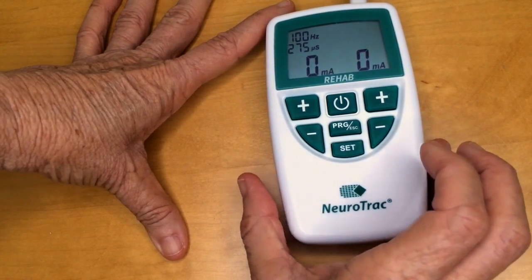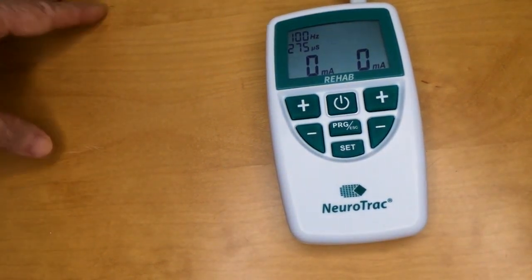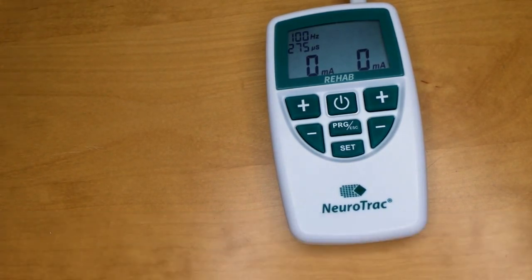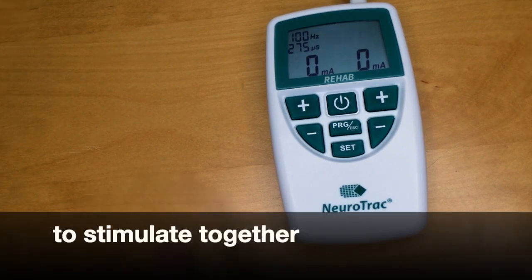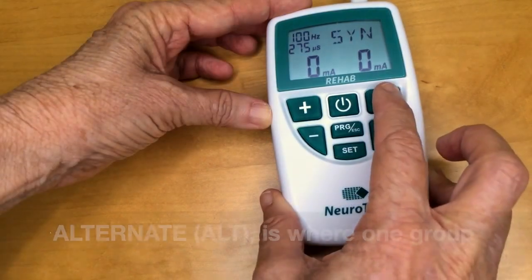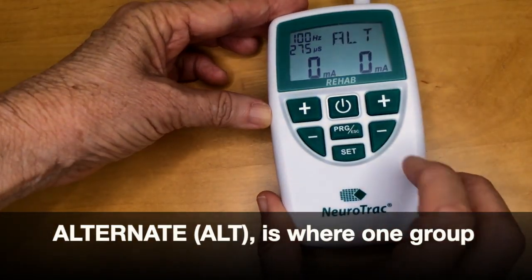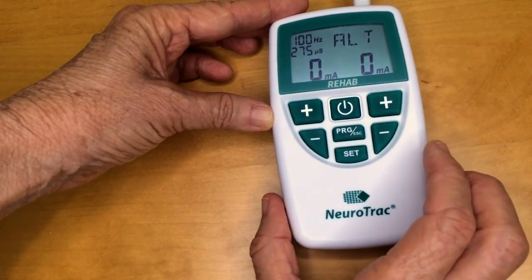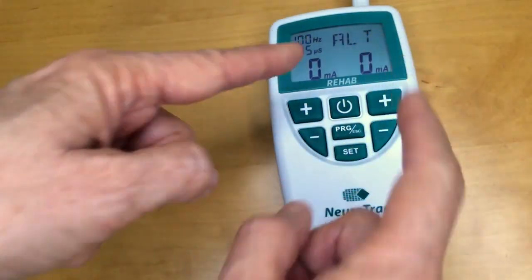Press set again and now you can see SYN is flashing on the screen — that stands for synchronous. Both channels are set to stimulate together or synchronously. For example, if you'd like the client to reach forwards, you might put electrodes on triceps and anterior deltoid at the same time and those two muscle groups would come on synchronously. Whereas ALT or alternate is where one group of muscles is switched on then the other — for example, triceps to reach and biceps to bend the elbow.